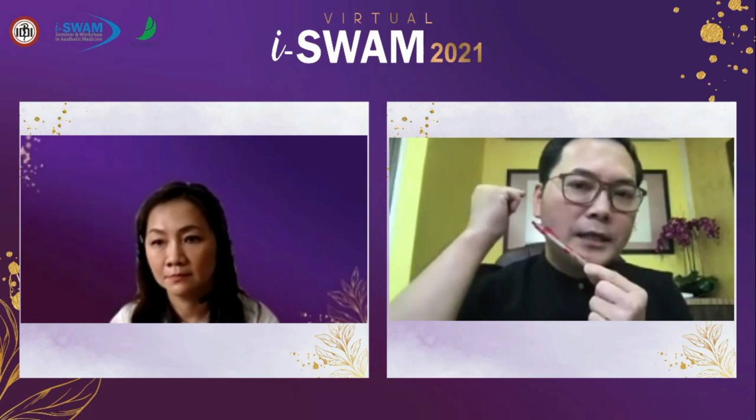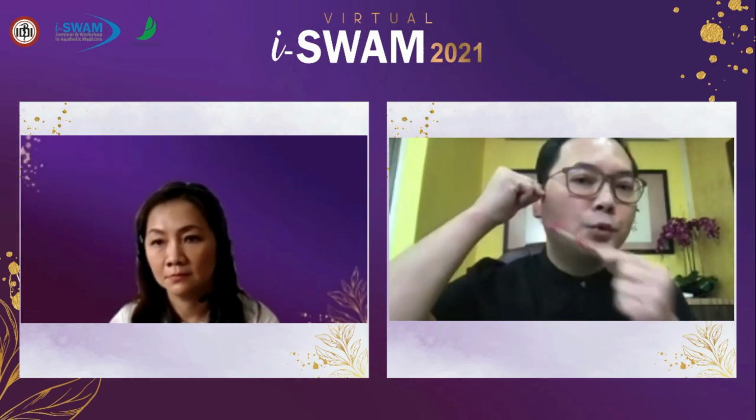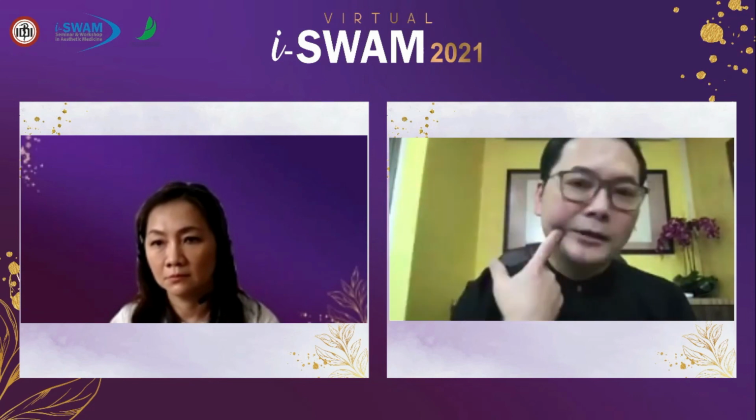If the fixation point has loosened, please pull out the whole thread. Don't pull a bit and then trim. If you trim, it means the fixation point has already loosened, and it will migrate down again. Maybe after 2 weeks, the patient will come back with another protrusion.